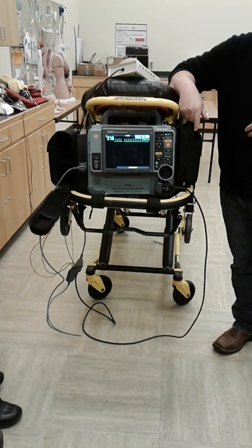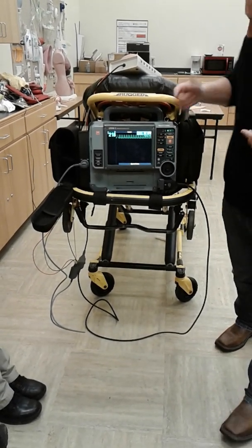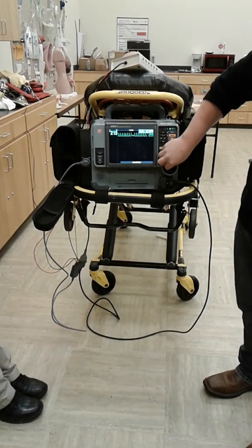Cardioverting, you don't have to have them on at the same time. I mean, you don't have to do it because you're going to do one item and that's it, cardioverting. But for this purpose here, we're going to take this patient back to lead 2. We'll be monitored.